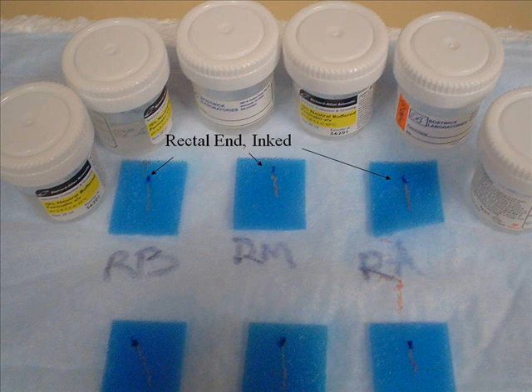Dr. Bahn? Yeah. I would like to ask you, I noticed that it says on the slide "rectal end inked." So are you marking which end of the tissue it is, so later on you know if there is penetration of the capsule? For example, this one is marked as right base, and we put the blue ink towards the rectal end of the tissue, as you see with the black arrow on this picture.